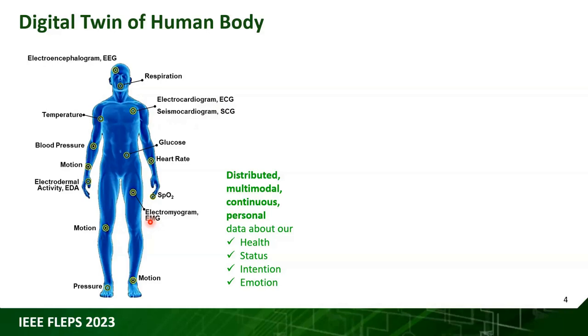But we also have mechanical signals such as respiration, the heartbeat-induced chest vibration called the seismocardiogram or SCG. We have blood pressure. Those are motion mechanical signals. We also have thermal signals. And we also have our chemical biomarkers that we have expert, Professor Wei Gao, who will tell you more today.